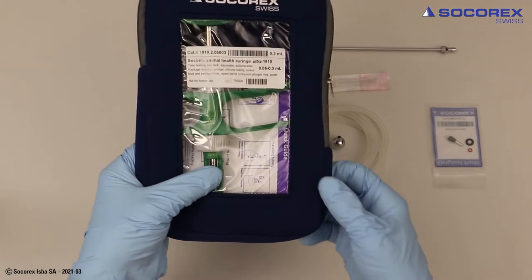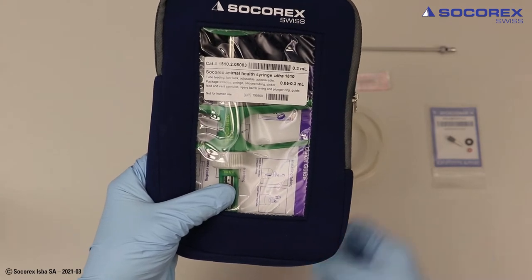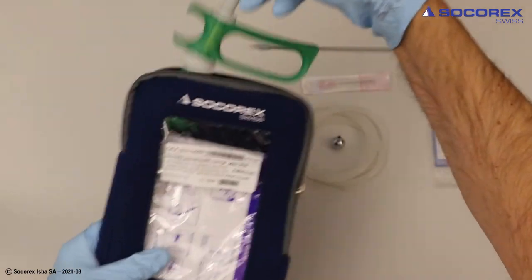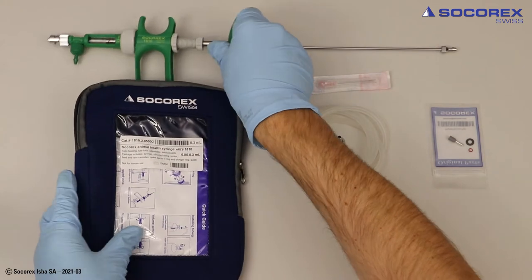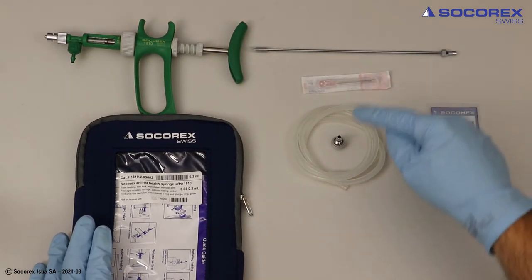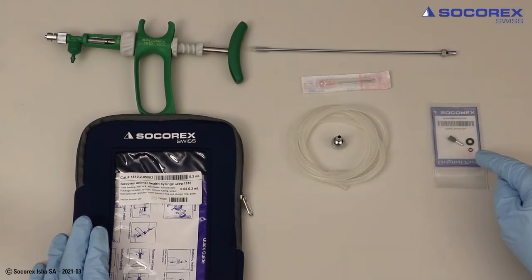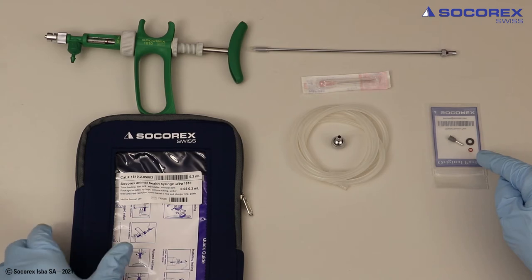The 1810 Ultra series is supplied in a smart reusable pocket. It contains the syringe itself, feed needle, vent canula, sinker, silicone tube, a small bag with o-ring, o-ring guide and washer.